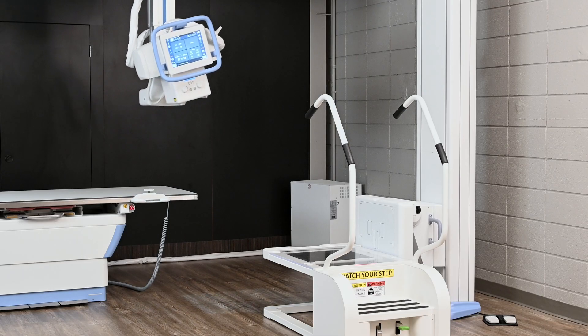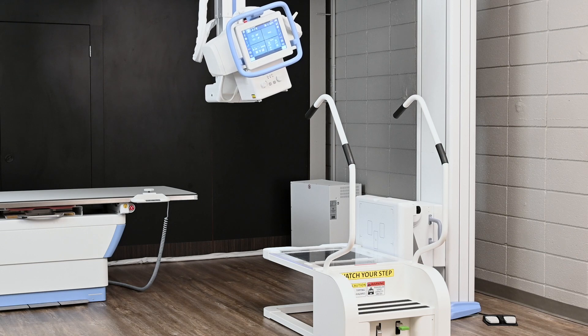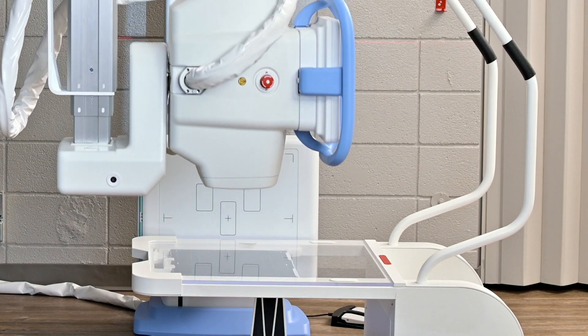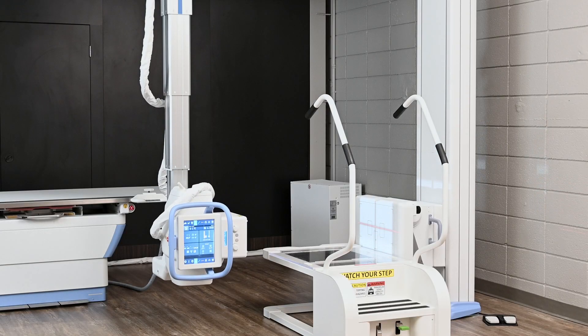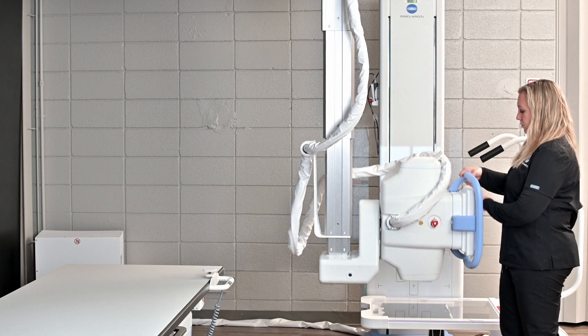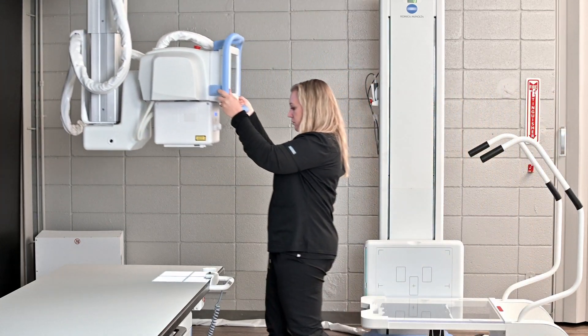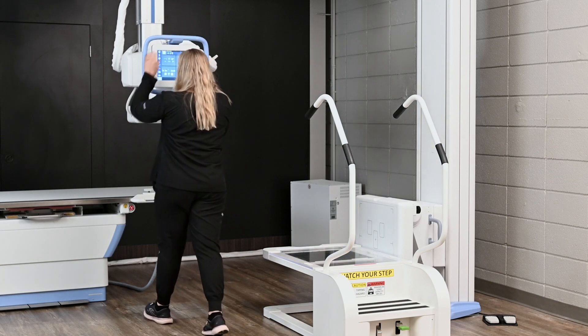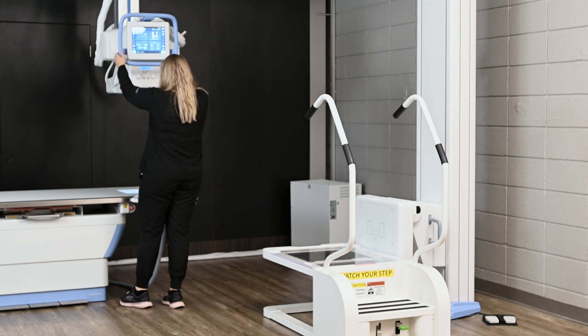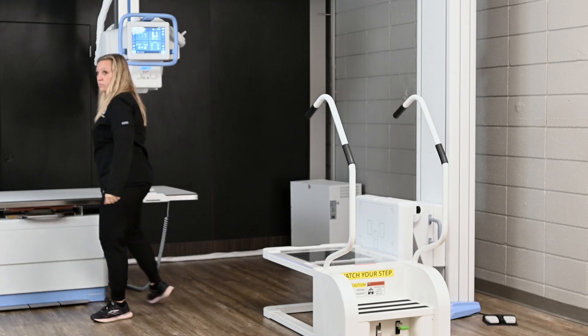Some of the great features of the Flex overhead tube crane include the capability of doing AP and lateral foot work without having to position the patient on and off the stand. In a dual-detector configuration, we have a detector on the weight-bearing stand for AP and oblique, and a fixed detector in the upright — allowing us to accomplish the whole exam without moving the patient up and down. At any moment when the exam is over, you have the capability of grabbing and going with the tube crane, giving you unlimited positions and unlimited capability with the manual overhead tube crane.